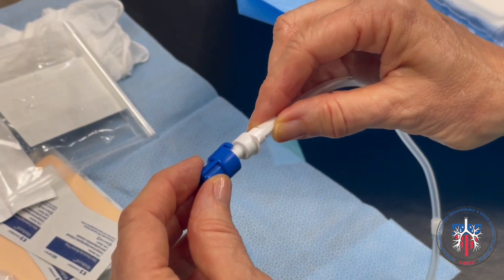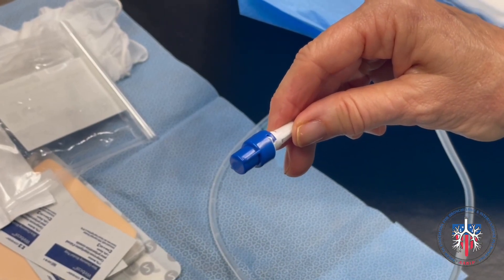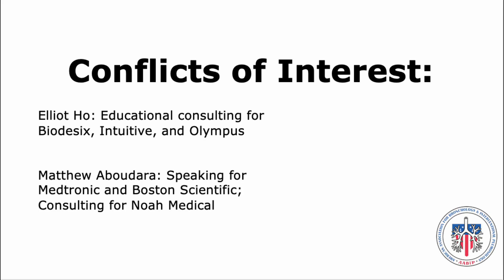Once drainage is complete, the blue cap provided by the Rocket Kit is attached to the Plurorex Catheter and locked into place with a twisting motion.